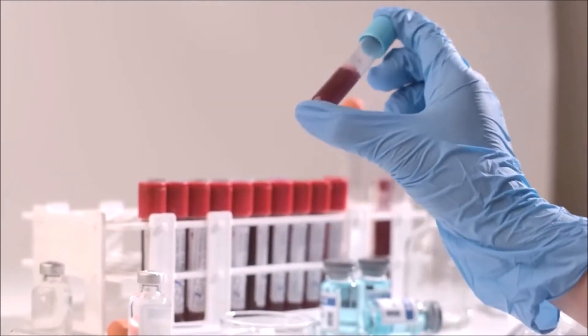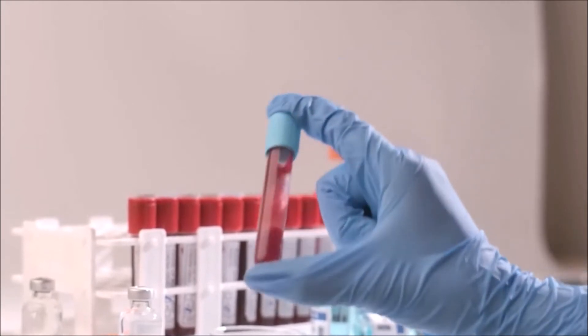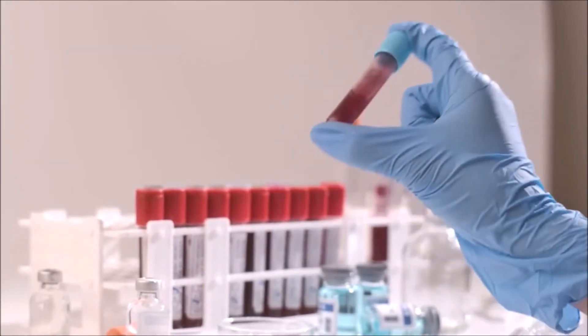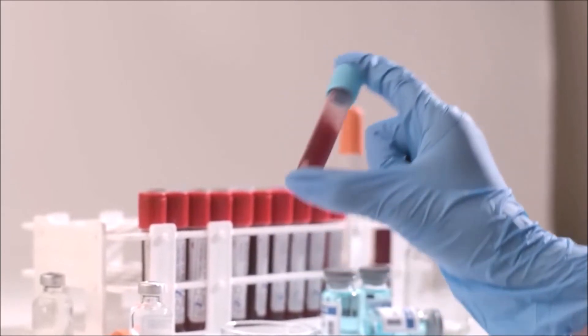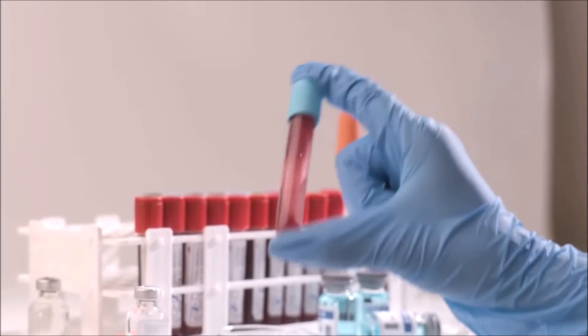Which blood collection tube will you use? That is the question we are trying to answer in this presentation. This video covers the blood collection tubes' common types used at the veterinary hospital. We also explain the additives in each collection tube and some of the tests that you would look to run with each blood collection tube.